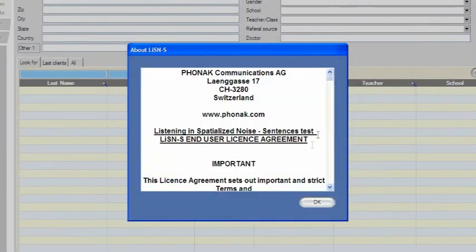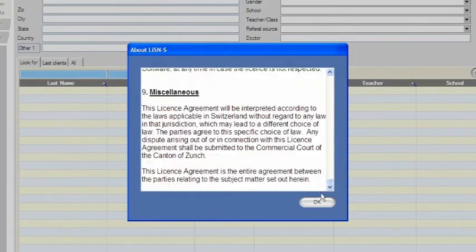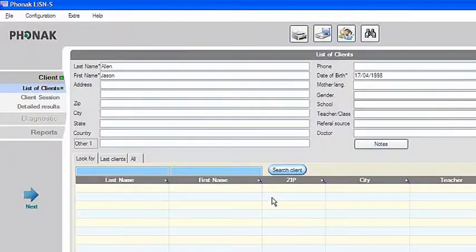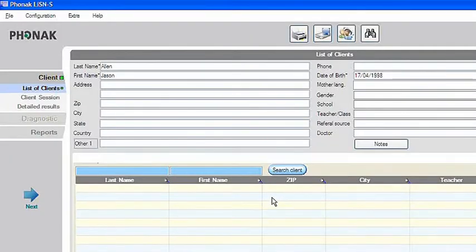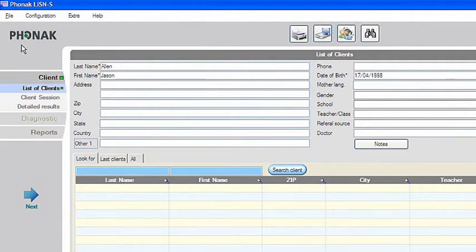Start up the Listen S software. When using Listen S for the first time, get yourself familiar with the layout of the screen. You'll soon appreciate how easy it is to navigate.